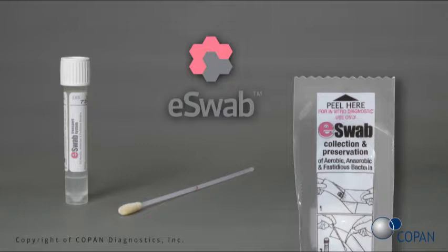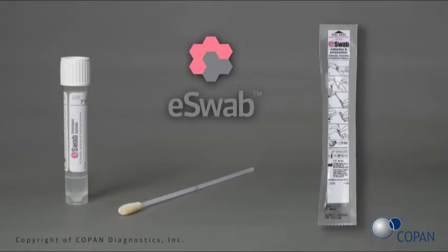The following video is a demonstration of the use of E-Swab to collect nasal samples for MRSA testing. Each E-Swab system consists of a sterile peel pouch package that contains a white nasal flocked swab with a pre-molded breakpoint, and a screw cap tube with one milliliter of modified Liquid Amy's transport medium.